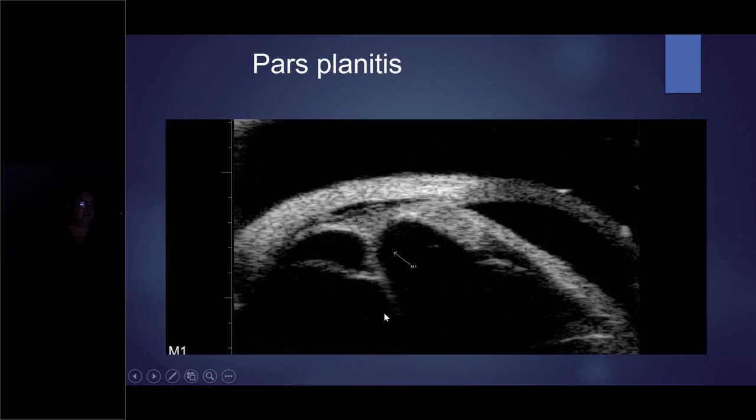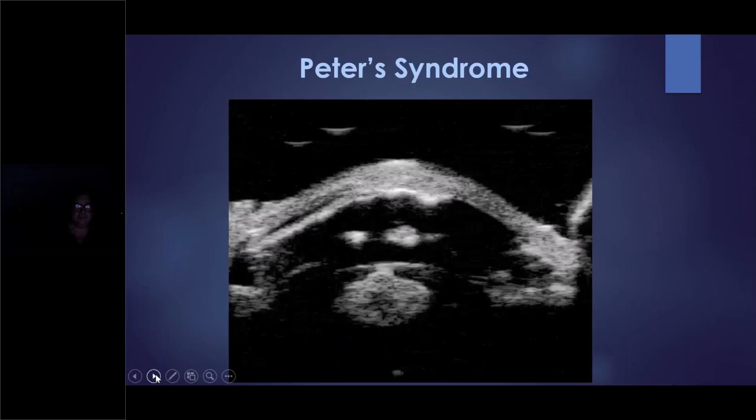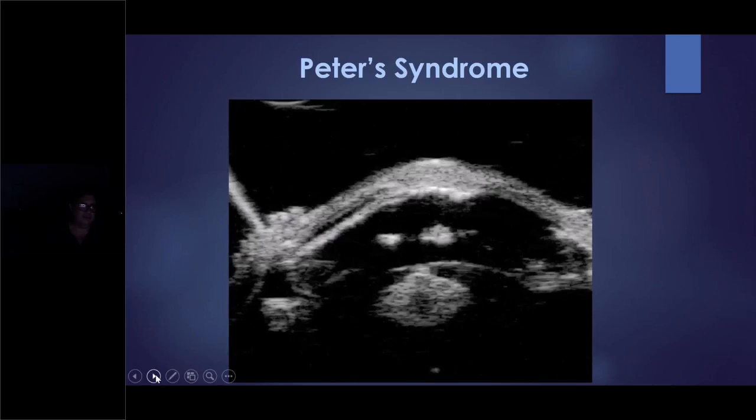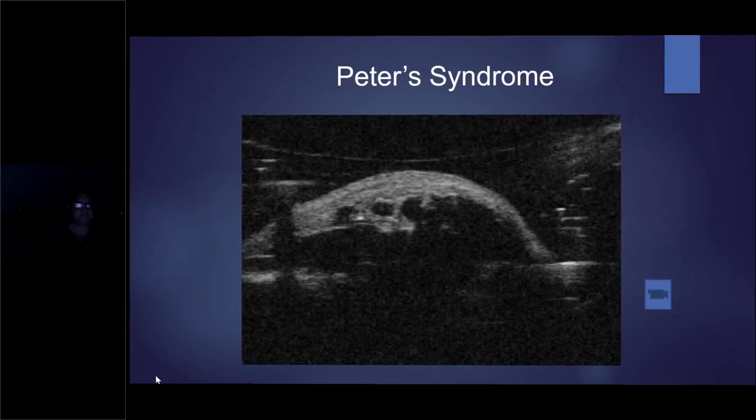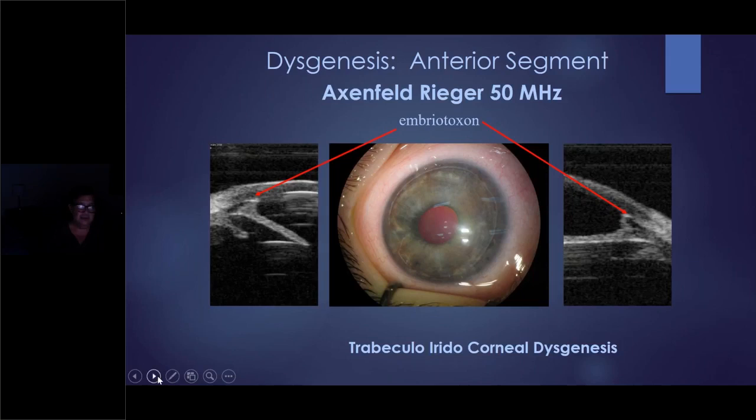Congenital disease, just for the very end, Peters syndrome. A very old movie, but this is still useful, with all the components of the Peters syndrome. Another one, also very old. Axenfeld-Rieger, you can see the Schwalbe line, the embryotoxon, and the trabeculo-irido-corneal dysgenesis. Axenfeld-Rieger again, with a membrane.